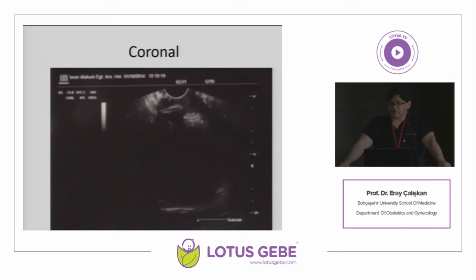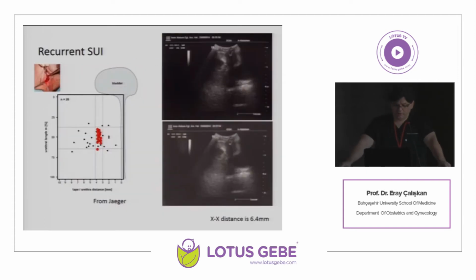We also use transvaginal ultrasound for the mesh. With this ultrasound, you can keep it in the entrance of the vagina, or you can just do a vaginal ultrasound, and while pulling back, you can trace the urethra and the bladder to see if there is any problem in the mesh surgery.